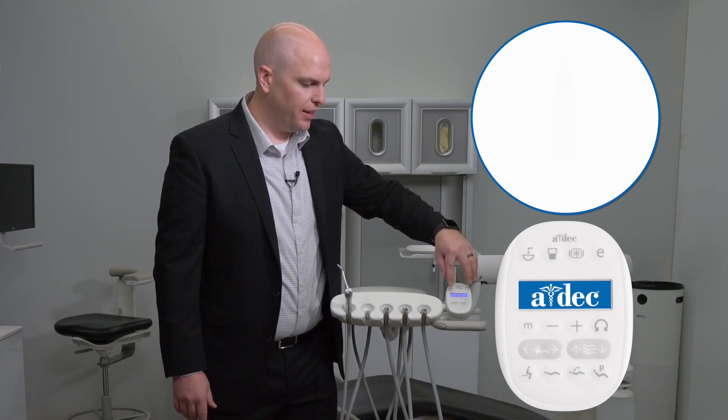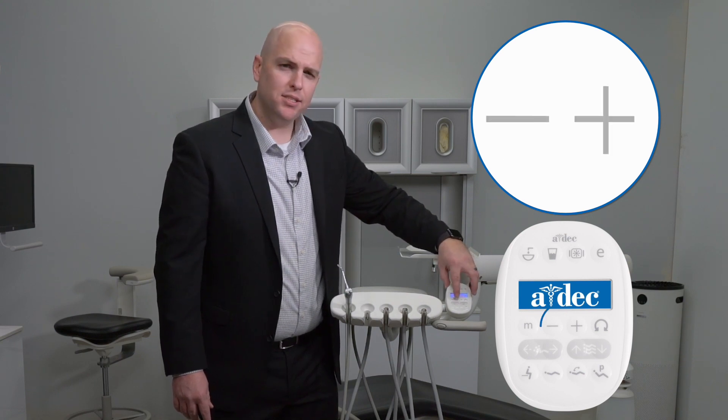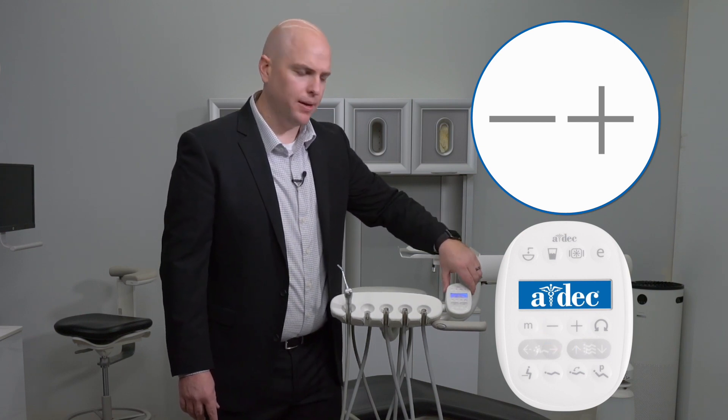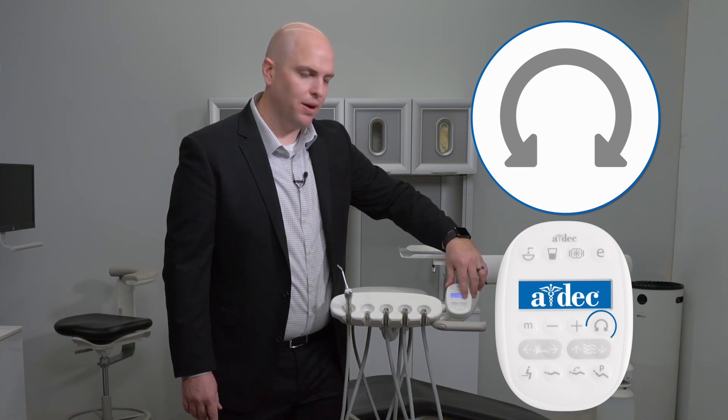Just below the screen on the left-hand side, you'll see an M. That M represents presets for your electric handpiece RPMs. Simply press the button to toggle through the different presets for your handpiece. Next, you'll see a plus and minus — those two buttons allow you to toggle between RPMs and make adjustments to other settings on the touchpad. On the far right-hand side, you'll find a button with two arrows, which also looks like a pair of headphones. That button is to change directions — forward or backwards — if you're using any of the endo functionality from your handpiece.